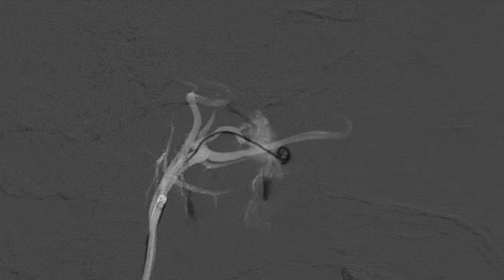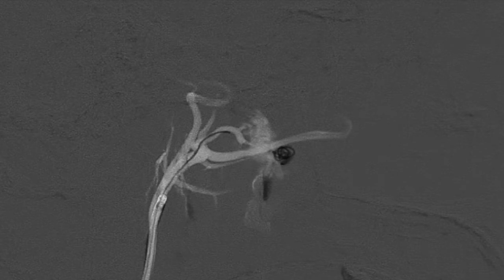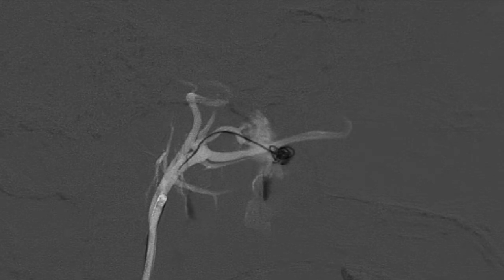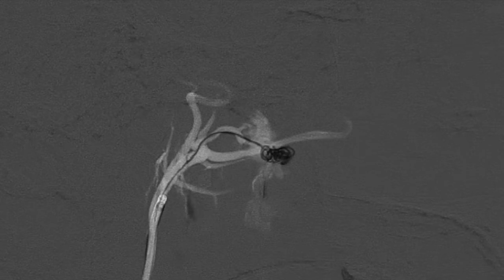embolization. The goal of coil embolization in this case was to slow down flow to the fistula and allow for embolization with liquid embolic agents without the risk for the agents flying downstream. We wanted to coil all the way back from the venous pouch to the actual feeding artery, and then use our liquid embolic agent to achieve a complete angiographic cure.